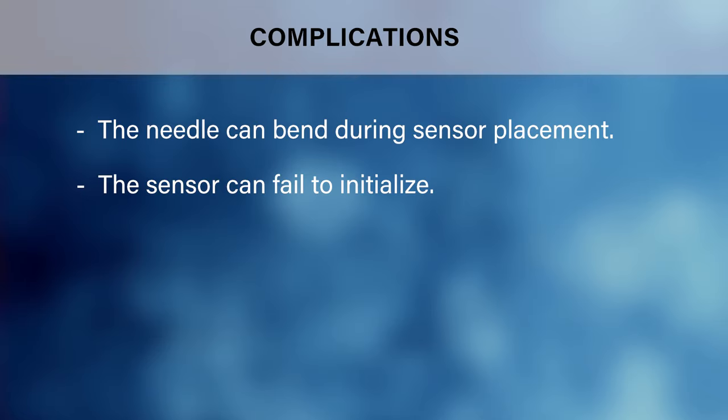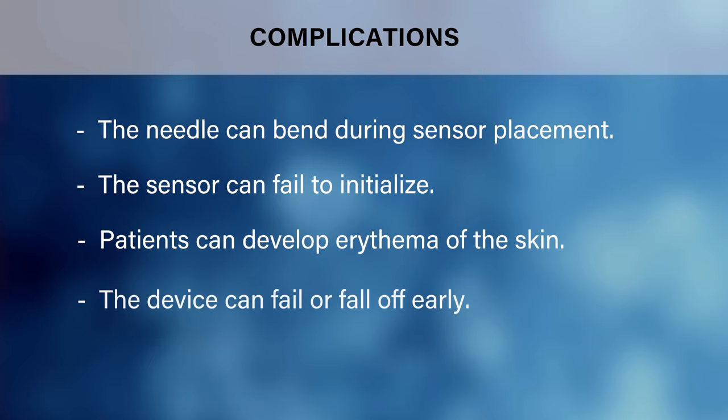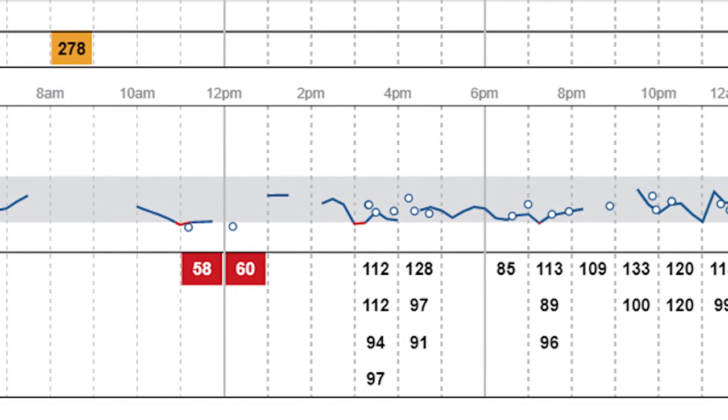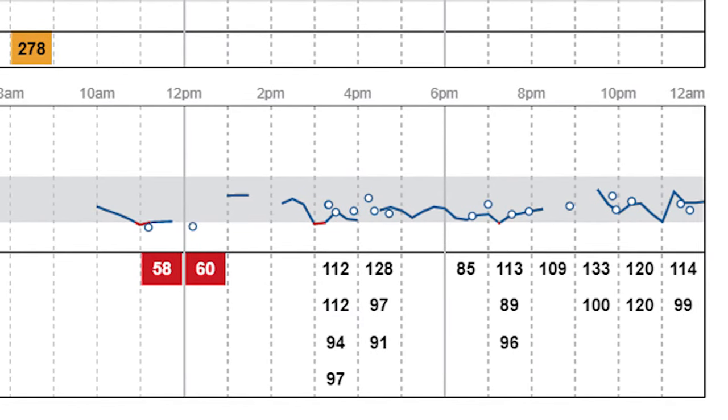Complications during the life of the sensor include development of erythema at the placement site and rarely abscess formation at the insertion site. Additionally, the device can sometimes fail or fall off early. Indications of sensor failure or impending failure include an error message, gaps in data collection, and low or high readings that do not fit with the clinical picture. Of course, in some cases, the patient removes the device prematurely.